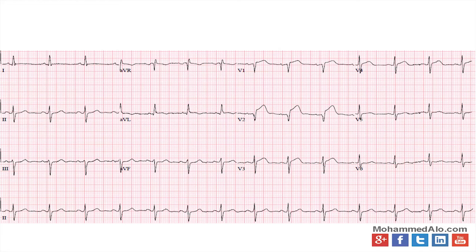Here's another EKG. What do you see here? If you look at V2, that is the correct shape. Concave down, that is your basic anterior acute MI. Even V1 is elevated, so septal anterior acute MI. V3, even the ST segment looks abnormal. V4 looks abnormal. But then V6 and 5 look pretty okay. There's no reciprocal changes. Remember, the anterior reciprocates to the inferior. 2, 3, and AVF do not look like they're going down.